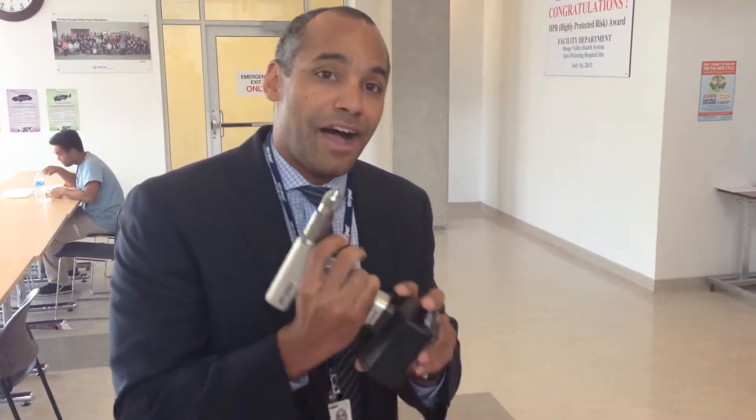So if someone breaks their ankle, has a femoral fracture and you need to fix it — these are the drills. Lightweight, easy to use, lithium ion battery technology and a bunch of different attachments.